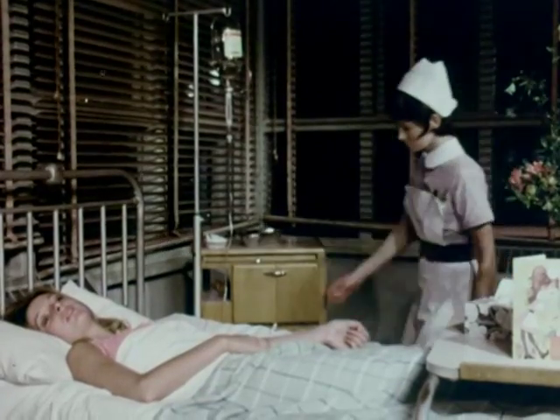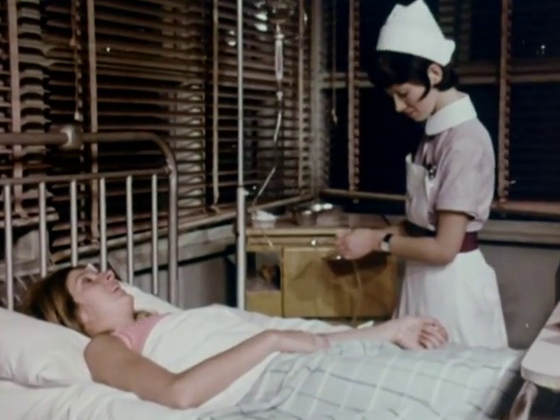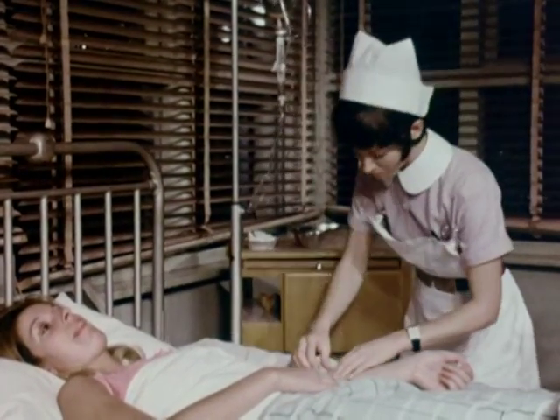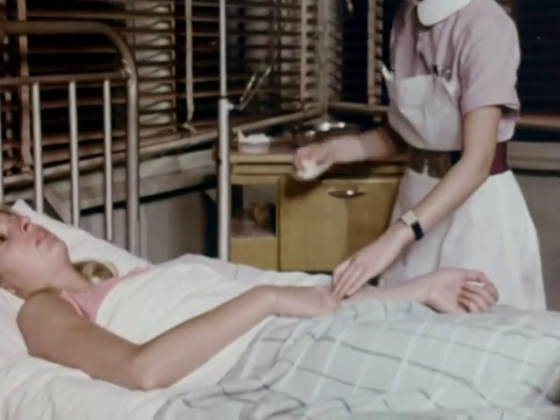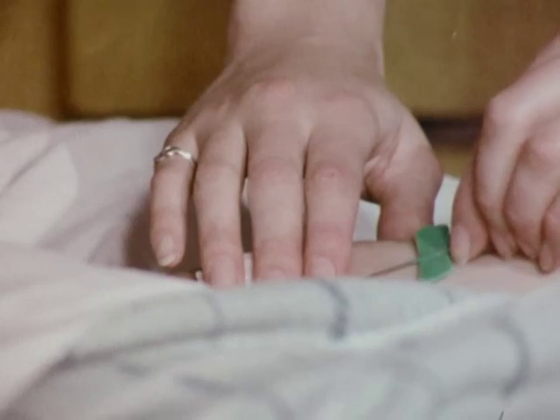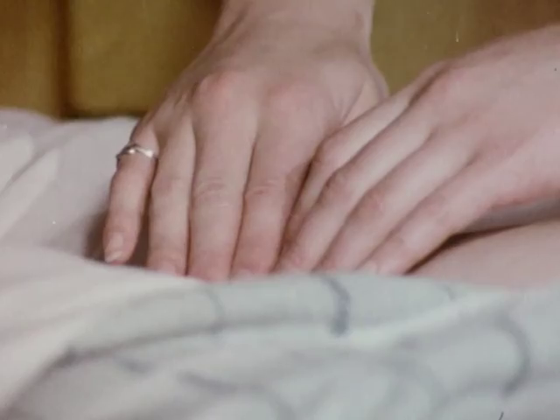When terminating an intravenous infusion, stop the flow of fluid by means of a clamp. With the butterfly needle held firmly in place, gently remove the adhesive tape by which the needle and adapter were secured. With one hand, place and hold a sterile swab over the site of injection. With the other hand, keep the hub of the needle flush with the skin and slowly withdraw the needle, taking care not to drag the tip against the posterior wall of the vein. Secure the swab over the injection site and apply pressure for 2 or 3 minutes to avoid a hematoma.